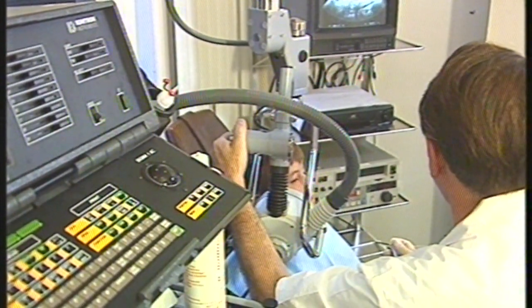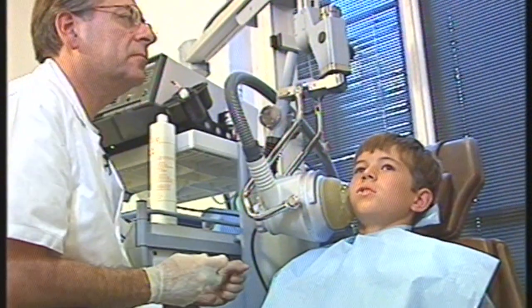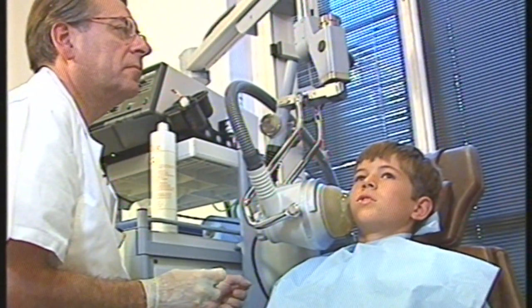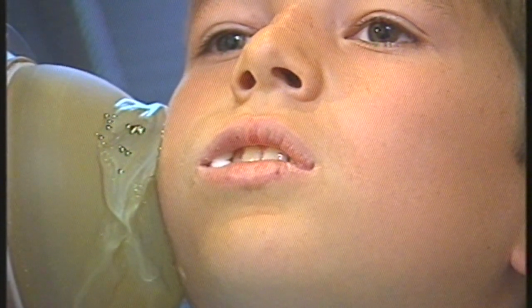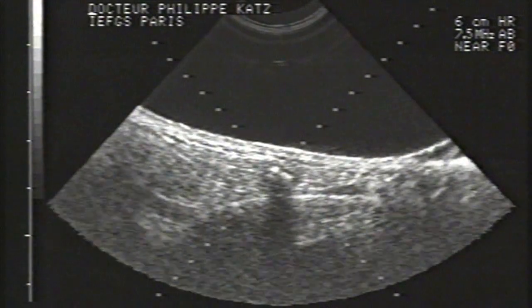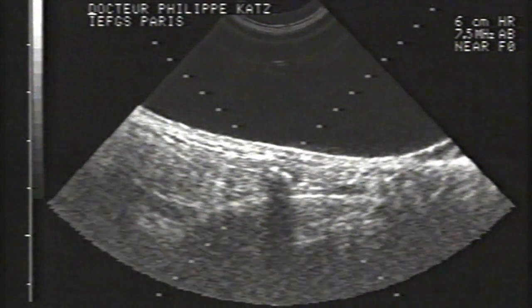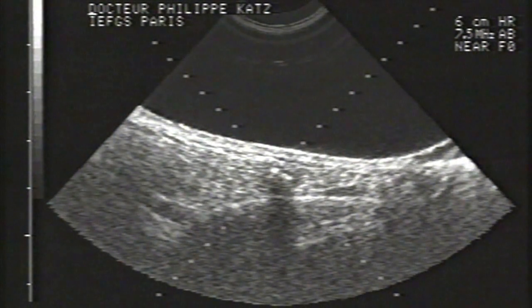This electrohydraulic shockwave lithotripsy is a nearly painless treatment due to its important wave focusing, preventing adjacent tissue injury, and anesthetics are not needed. The treatment can be performed on children. The sessions are repeated after a 1-month delay, and antispasmodic and sialagogue treatment are prescribed for 10 days after a lithotripsy session.